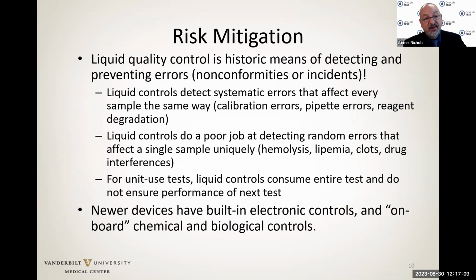And we have to realize for a lot of our point of care testing devices, for unit use tests, they are a single cartridge, single test strip, a single test at a time. When we run liquid QC on that test, we've consumed the entire cartridge, and the very next test, the next cartridge, may behave a little bit differently.